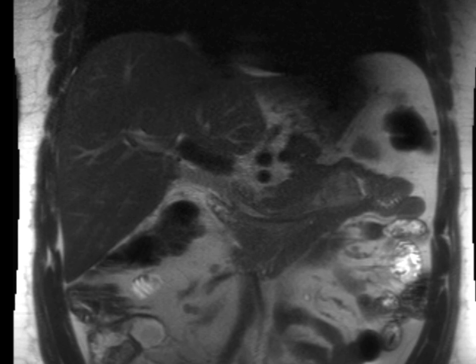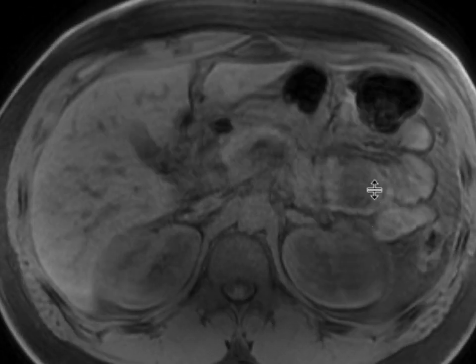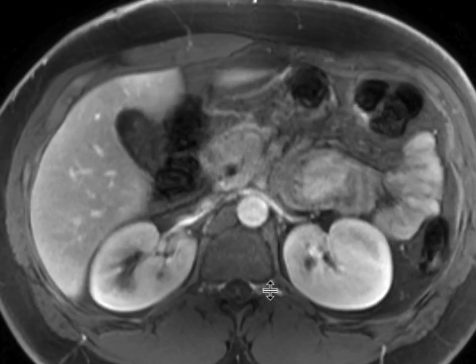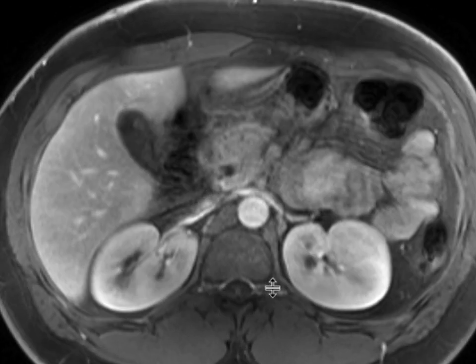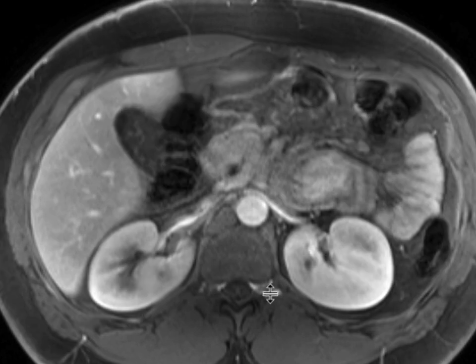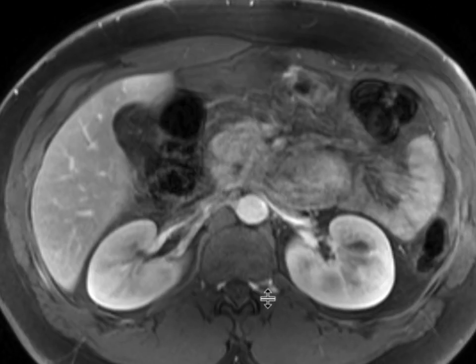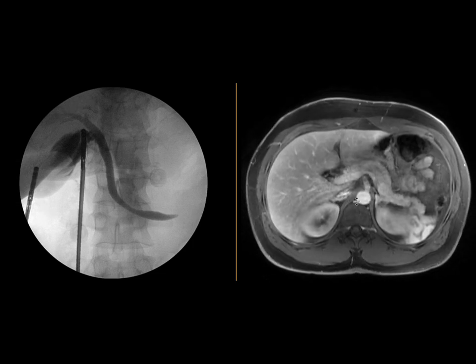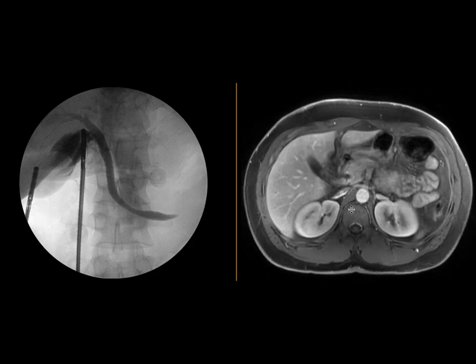We can see that mass on the T1-weighted images as well — it's hypointense right over here. And this enhances after we give contrast. This essentially was a mass at the ampulla that had intussuscepted into loops of small bowel more distally, resulting in that medial deviation of the common bile duct.